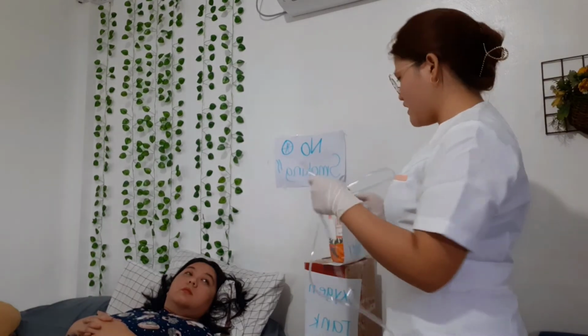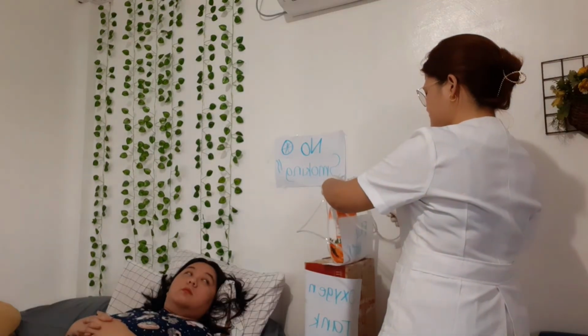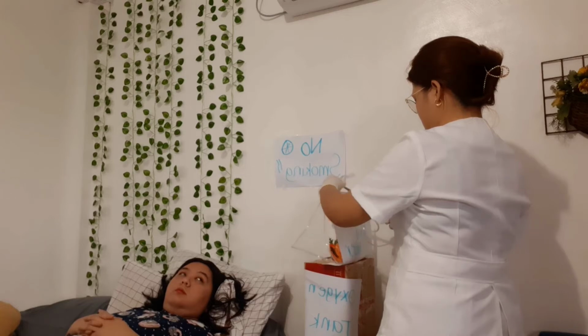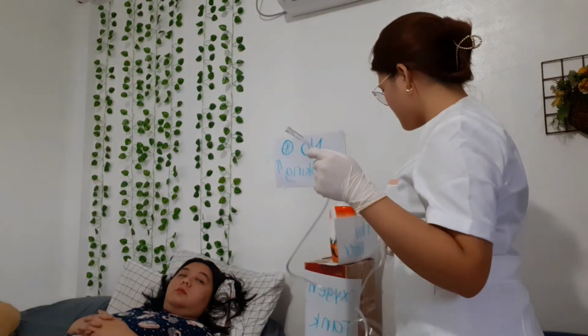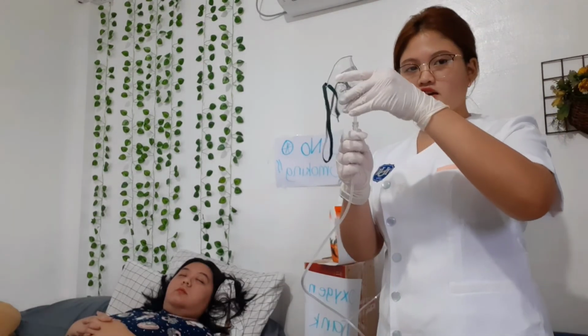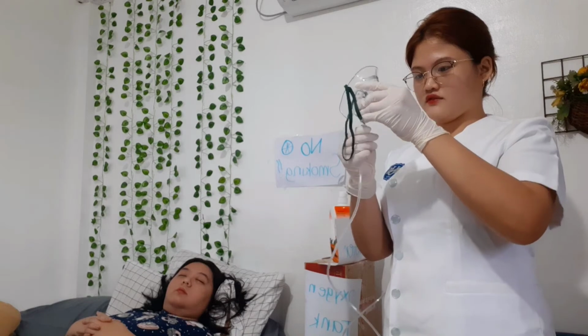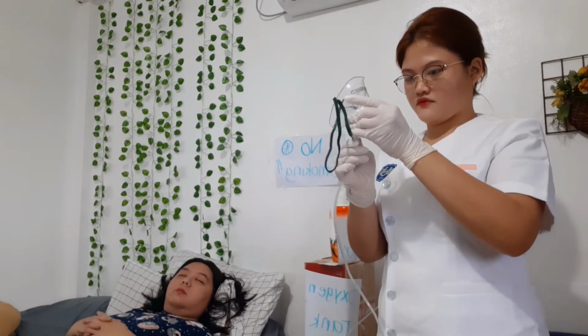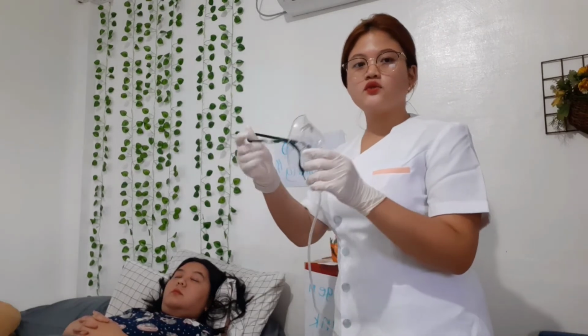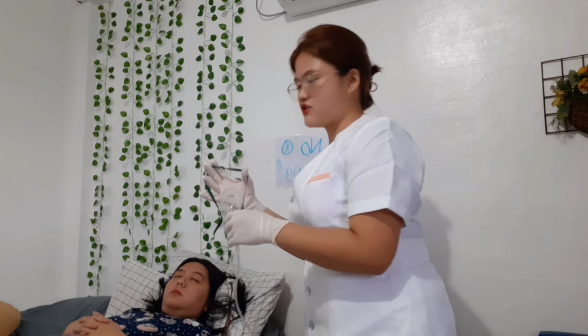So I will place this one to the humidifier. So I have only the simple face mask, not the non-rebreather mask. So I have here the simple face mask, and I will connect it here. So after connecting the tubing, you need to connect it to the patient.